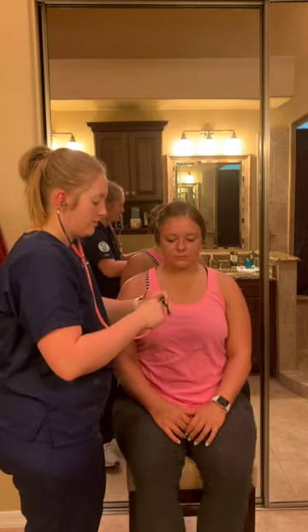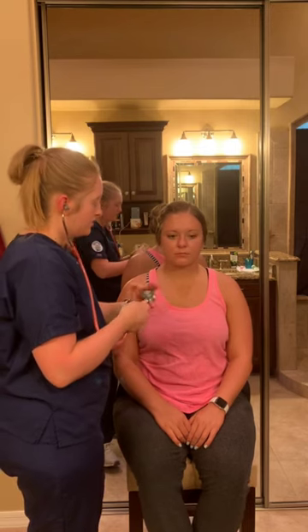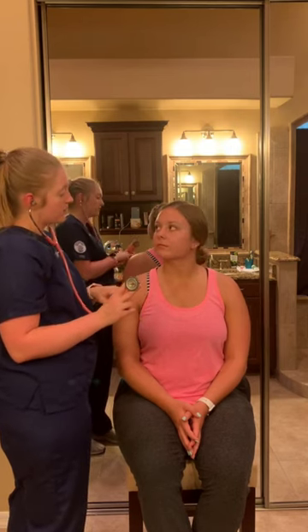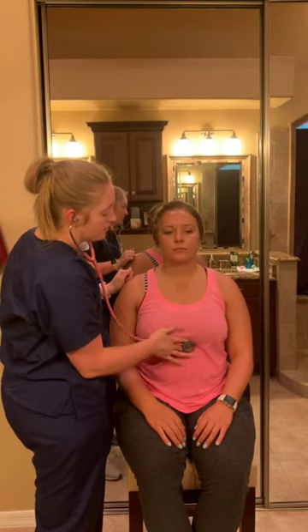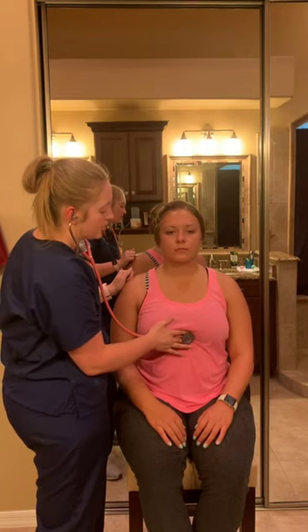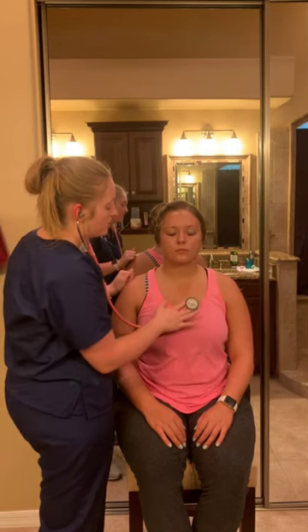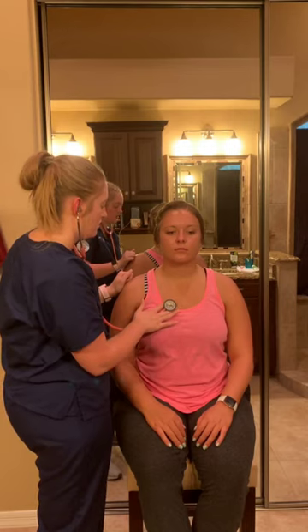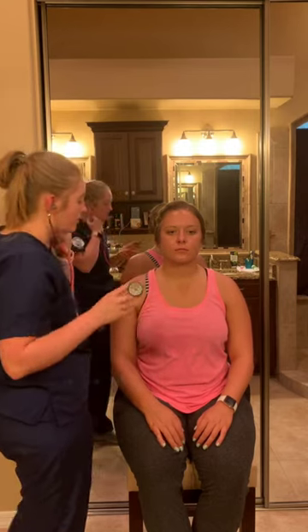For the apical pulse I got 68, which is nice and normal — normal range is 60 to 100. Now I'm going to go back and listen to all the valves using the bell of the stethoscope, going in reverse: mitral, tricuspid, Erb's point, pulmonic, and aortic.